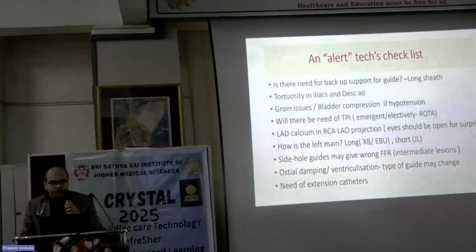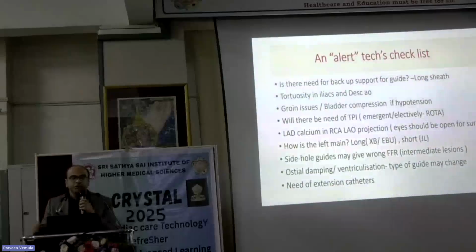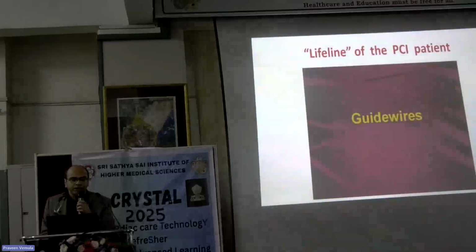Calcium is something that you should see in the coronary. Correct. So you are prepared, as you said, with your rotablator or XYZ, cutting balloon, etc. And a lot of this is learned on the job. I'm not saying everything is here.